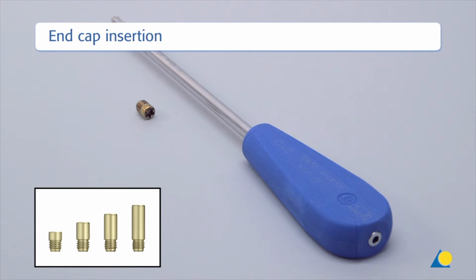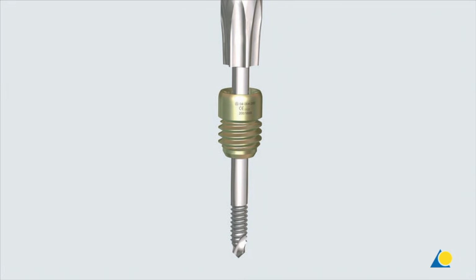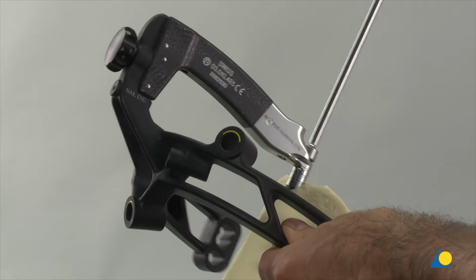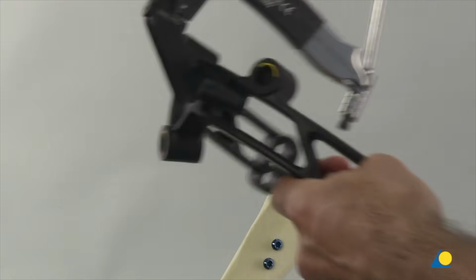End caps for the ETN are available in extension lengths of 0, 5, 10 and 15 mm. In this exercise, the 0 mm end cap will be inserted using the screwdriver star drive T40. The end caps are cannulated for use over a guide wire if necessary. End caps prevent bone growth into the nail, and they extend the nail height if it has been over-inserted. The screwdriver, hexagonal 8.0 mm diameter with spherical head and T-handle, is used to loosen the connecting screw so that it can be removed together with the insertion handle and the aiming arm.